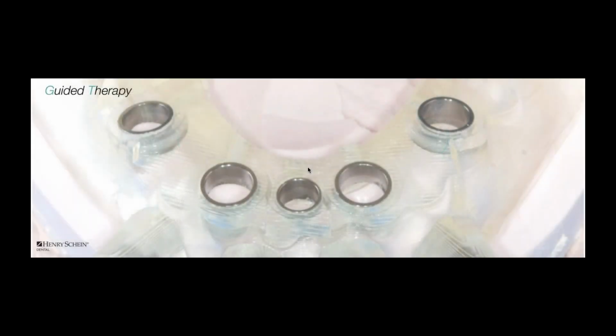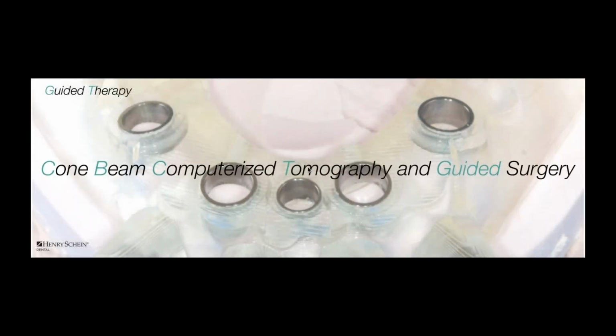And the answer in the world we live in today is very simple. It's cone beam computerized tomography and guided surgery, right? We need to take a CBCT, but as I mentioned at the beginning of this program, we can't just take the CBCT and measure 10 millimeters. We need to use that information, acquire the data, and use the data through some sort of guided protocol.